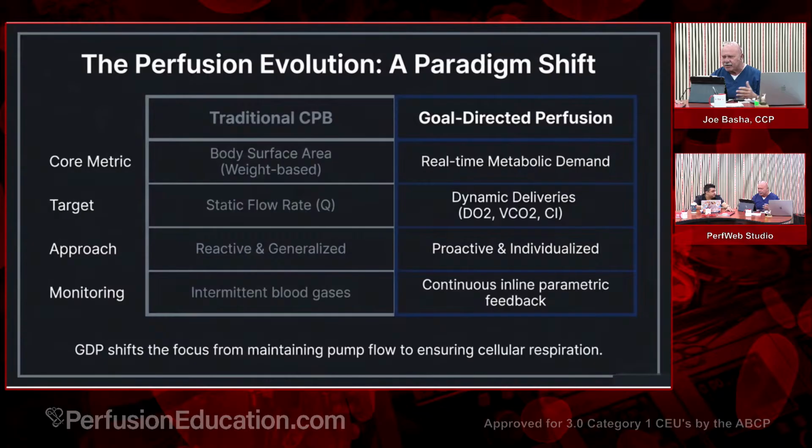It can do saturation and CDI hemoglobin. It was never accurate, though. No, it really isn't. And that's part of the problem. You have to calibrate it on every blood gas. Yes. So what's the point at that point? Correct. It would be very nice to have an actual real-time, continuous inline monitoring.